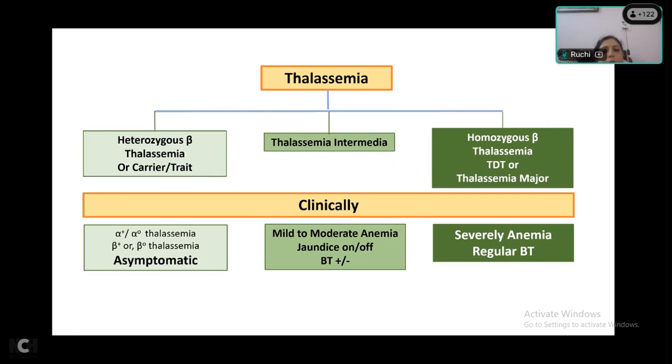Clinically, अगर मेरे पास मुकुल सैंपल भेजेगा कि मैम इसको on and off jaundice है and on and off anemia है, एक blood transfusion इसको 2 साल पहले मिला था और अभी कुछ हुआ है and recently received another transfusion. So I'll put this patient in the broad category of thalassemia intermedia. So why do I say thalassemia intermedia is actually a broad category? It is clinically defined. कि अगर ऐसा symptom है तो हम सोचते हैं कि thalassemia intermedia है.